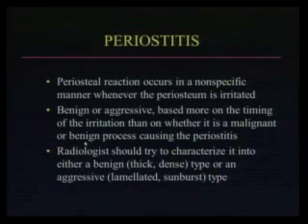I want you to tell me the spectrum of periosteal reactions, okay? From the benign to the most aggressive. Who wants to do that? Medical students? Go ahead. Okay, so let's start. Do you want to start from the benign side or from the malignant side? Benign. Okay, benign.